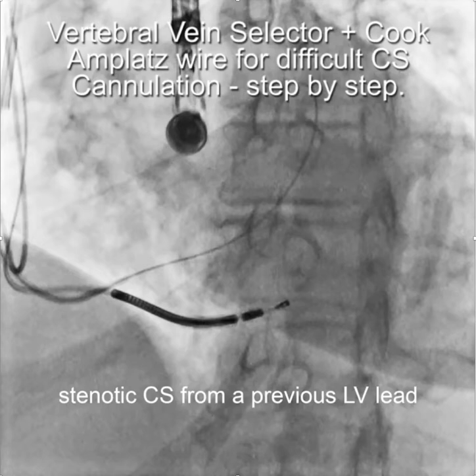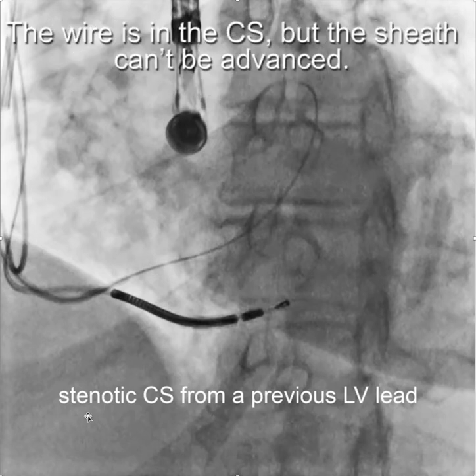This video describes how to use the Amplatz wire, and particularly the Cook Amplatz wire, in combination with a vertebral vein selector for difficult CS cases where there's difficult CS cannulation. The example here is a patient with a stenotic CS from a previous LV lead where you can see the glide wires in place, but it wasn't possible to advance the sheath into the coronary sinus.